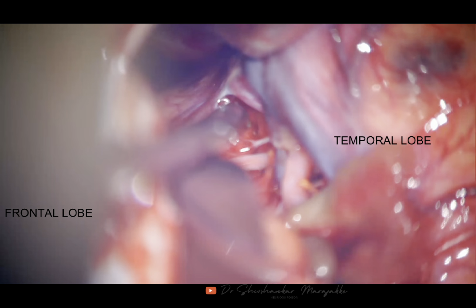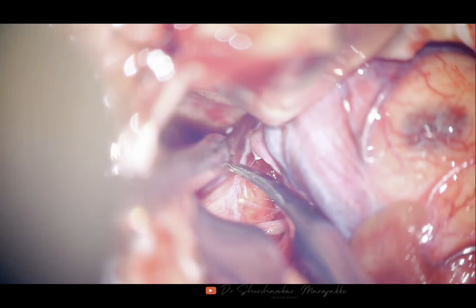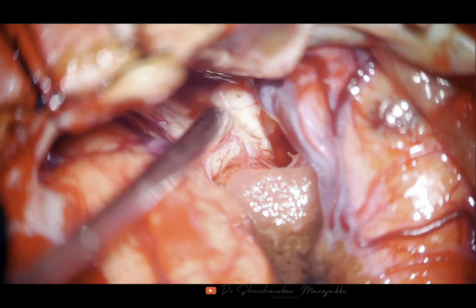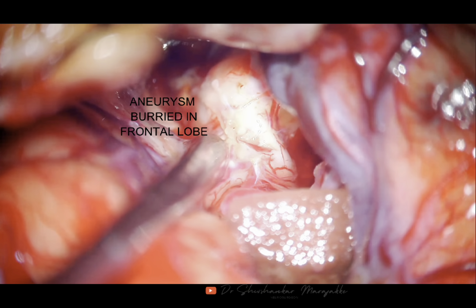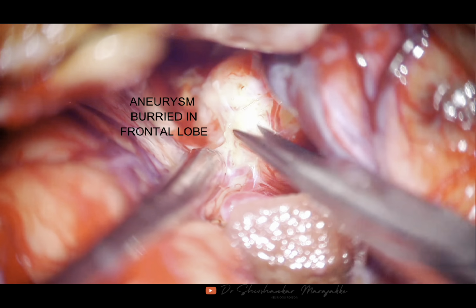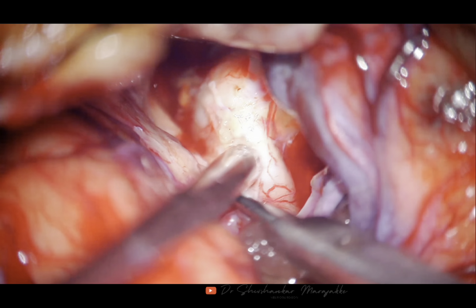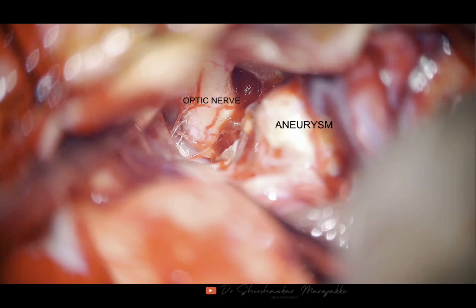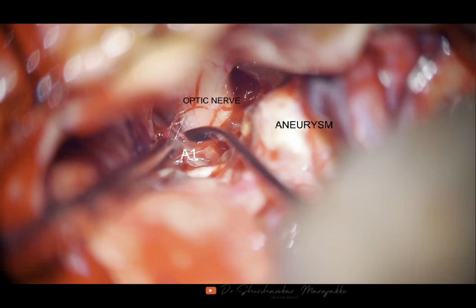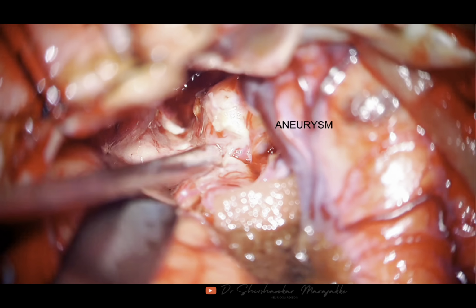We have to be careful that whenever we expose an aneurysm, the proximal part of the vessel of the aneurysm has to be exposed, because if it ruptures, we have to catch hold of the proximal part of the vessel for temporary clipping. You can see here the fundus is buried into the frontal lobe. That is the optic nerve there, and under that we can see the A1. So it is dissected off from the frontal lobe and the optic nerve.